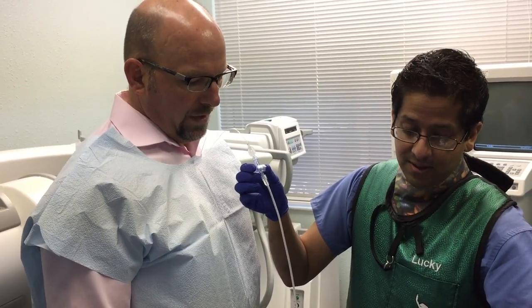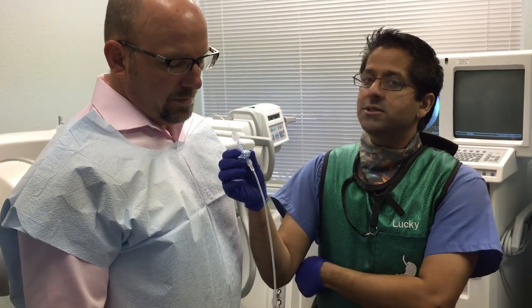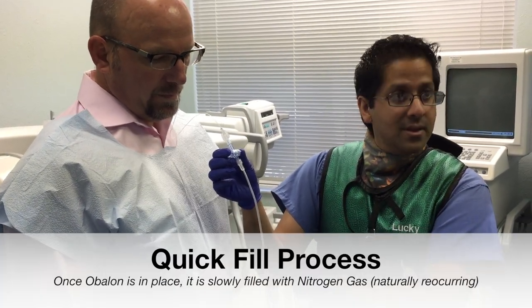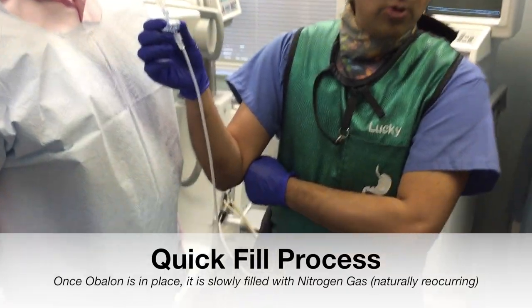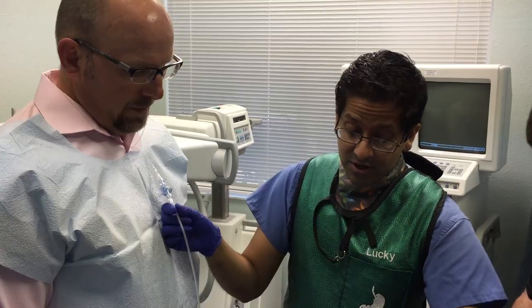If you're looking at the numbers, Steven, the numbers will slowly drop. Okay, it takes its time and we give it all the time in the world. 0.7. Yes, less than seven, and it holds less than seven. So at this point Steven swallowed the pill, we've confirmed that it's in the stomach, and we're just allowing it to blossom, as I call it. Start inflating.